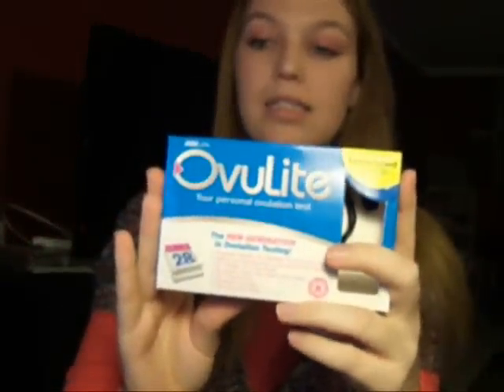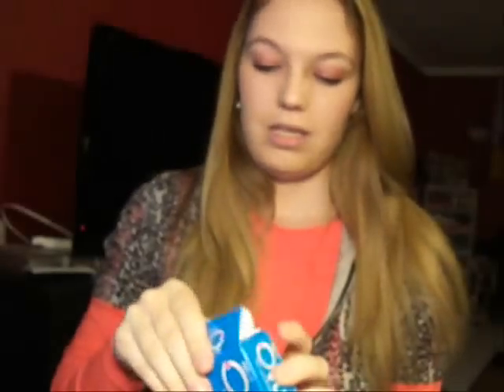This is the ovulite ovulation device. Basically, it's a little device that looks like this. You pop this off. This is just the lid. And then the device looks like this. You pop off the lid, or the top of it, and this right here is where you're going to apply saliva. So you dip your finger in your mouth, you dab on a little bit of saliva, make sure there's no air bubbles. You put it down and let it set for 7 to 10 minutes, I guess, so it can dry a little bit.